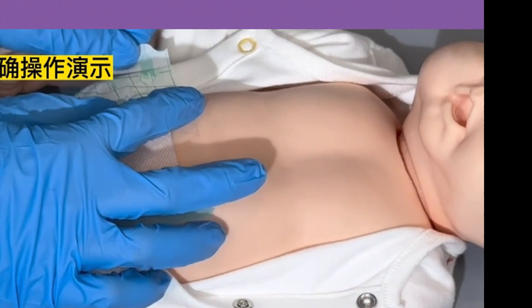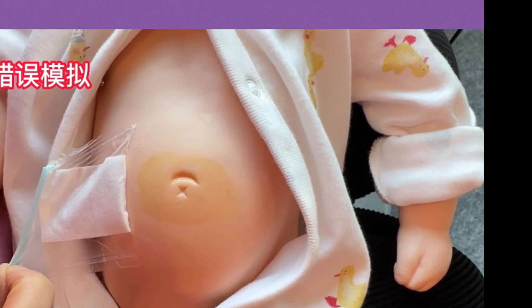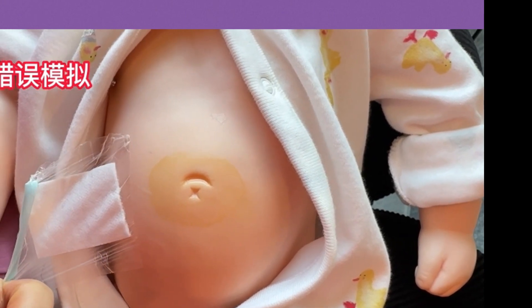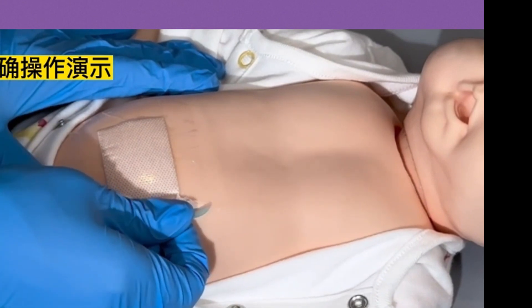Press lightly with your palm for 10 seconds so the patch sits symmetrically. The third point: do not lift a corner when removing it and tear in turn. The correct way is to use painless peeling.